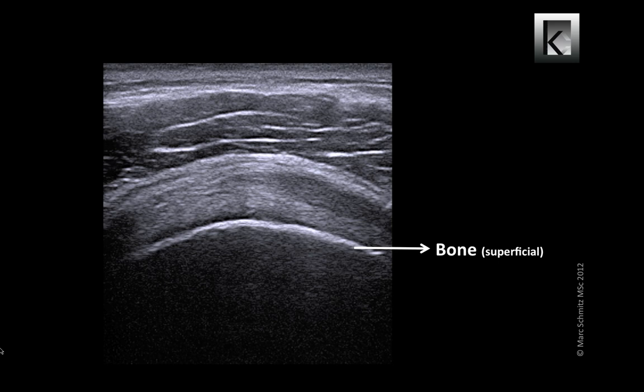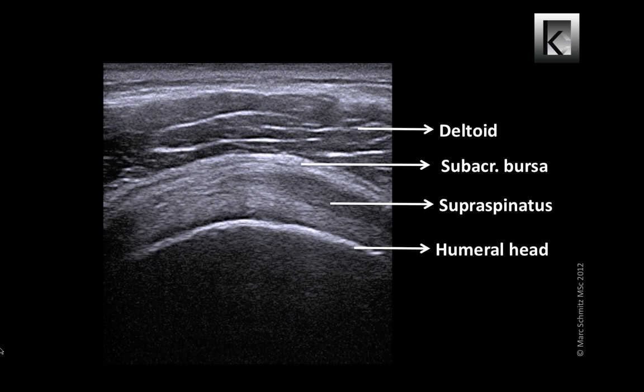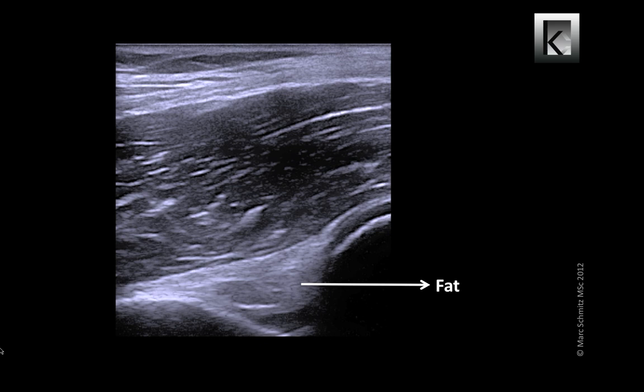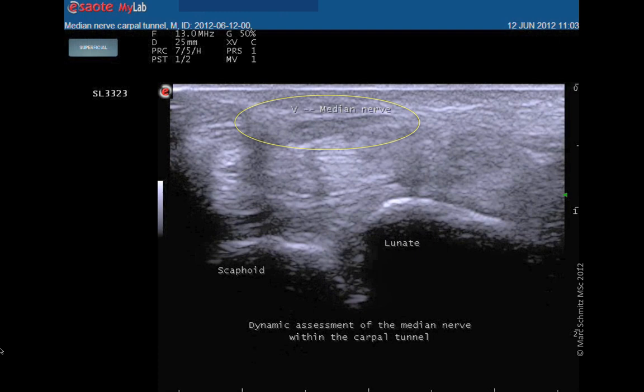Other structures that we can visualize with MSU are fat — for example here in the elbow's coronoid fossa — and nerve. Here, a dynamic assessment of the median nerve in the carpal tunnel, with in the depth the moving flexor digitorum superficialis and profundus tendons.